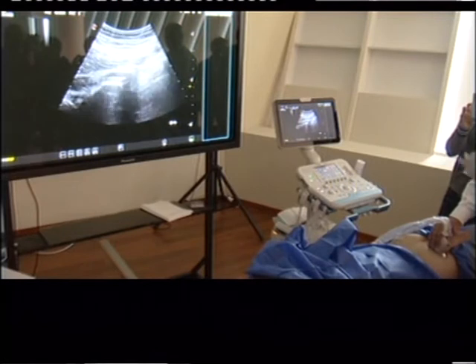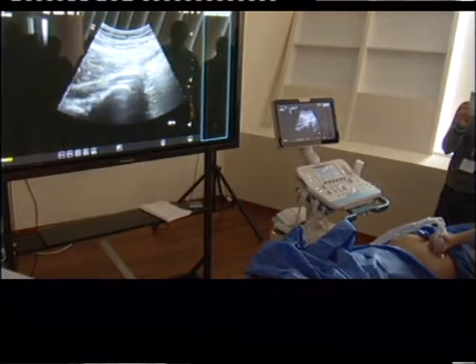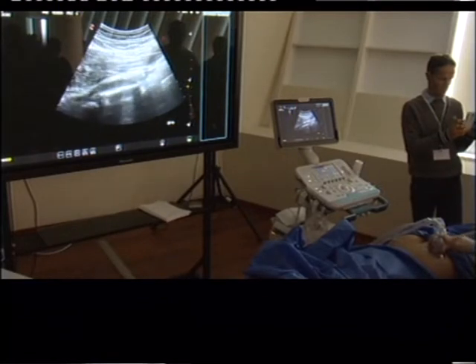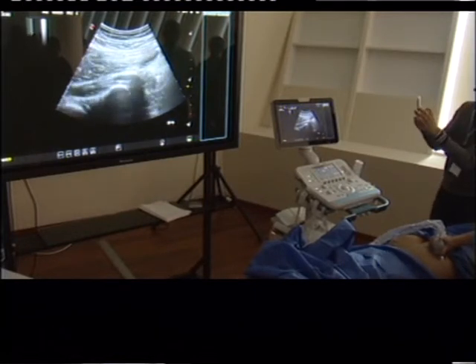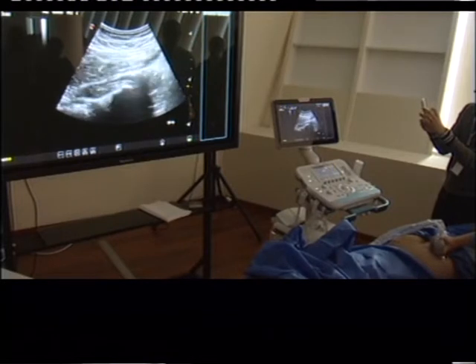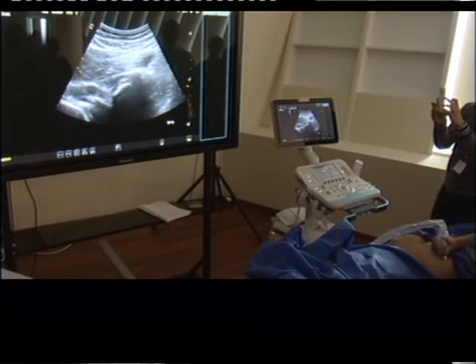Now we go down here and we have the waterfall. Then the sciatic nerve, on the left, right there. Now we come in here, up against the bone, and inject the bursa and the tendon, and then go down some more. The bursa is between the bone and the waterfall. Luckily he doesn't have one, he's too young. Now keep going down, caudally, and hamstring. See, right there. So we'll have a spur sticking into the obturator.